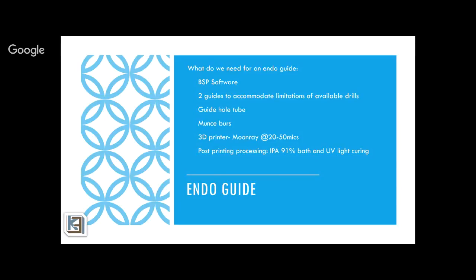One of the limitations that we have at this point is there is no guide tube, a metal tube or sleeve that would accommodate these burrs. So far, I've only been able to use this without a sleeve.